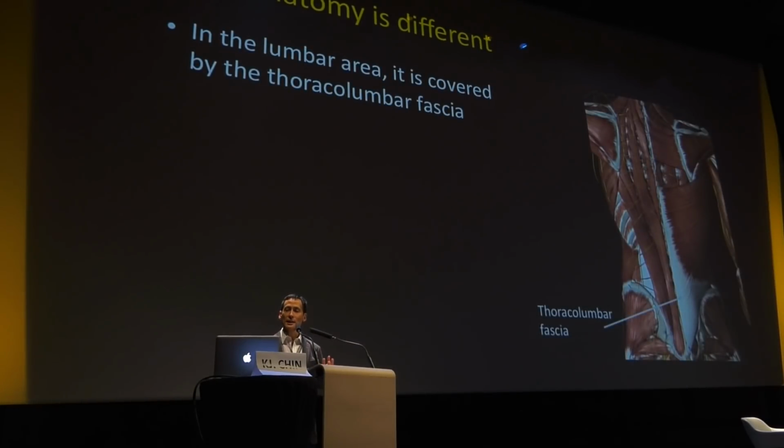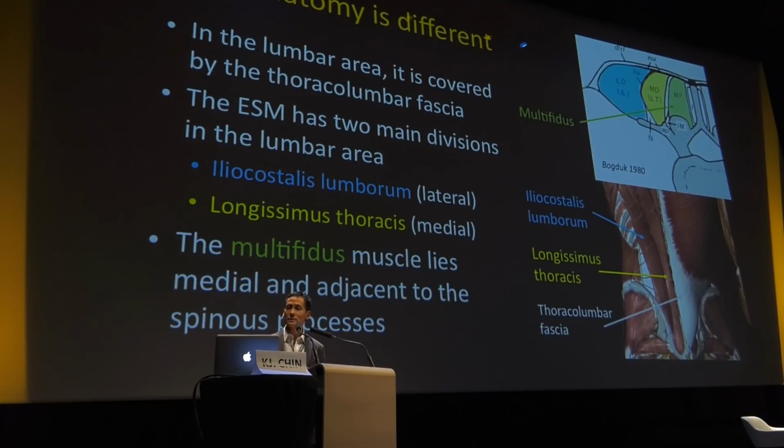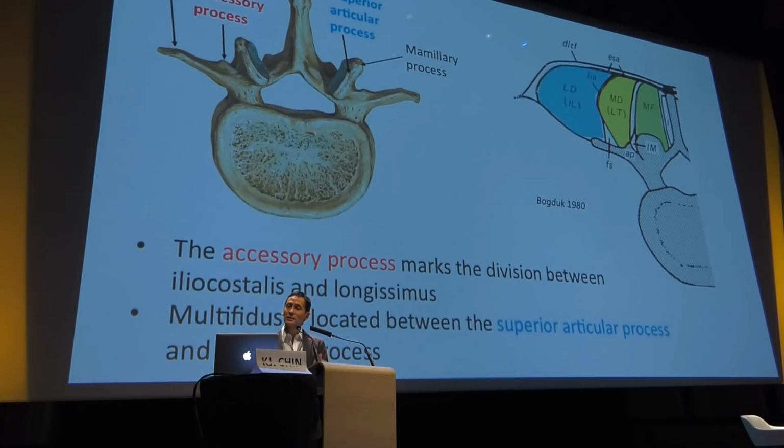Also, the muscles change slightly. In the lumbar area, there's this pronounced thoracolumbar fascia, and there are actually two large muscle components, iliocostalis and longissimus. And close to the midline, there is also the multifidus muscle, which you don't have in the upper area. It's not such a pronounced structure. And when you look at the bony shadows, these show you too where the planes of these muscles are. The accessory process, just between the transverse process and articular process, is where the iliocostalis and longissimus junction is, and then multifidus is where the articular process and the spinous processes meet.